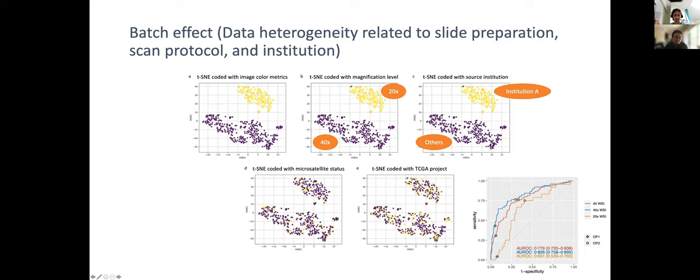We extracted the color features from the whole set of images, applied dimensionality reduction, and plotted them in a two-dimensional space, and we applied clustering. This time, we used DBSCAN. There were two discrete, perfectly separated groups of slides.